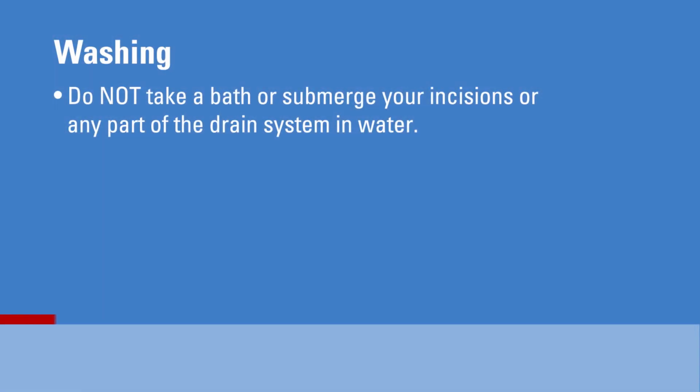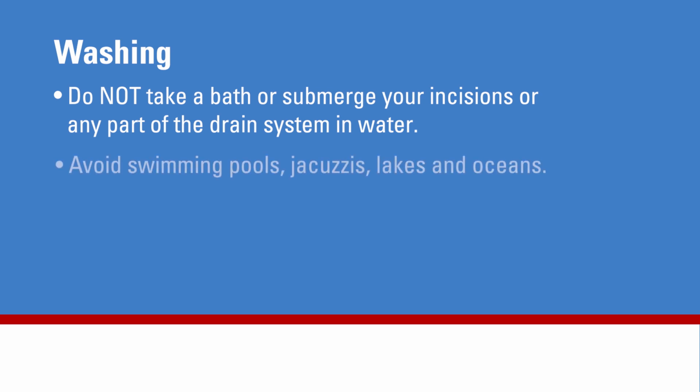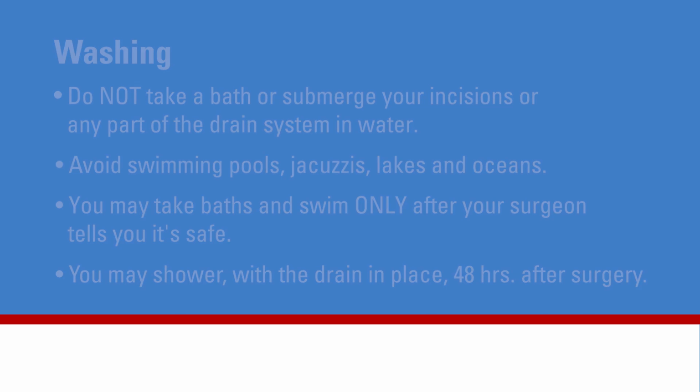Do not take a bath or submerge your incisions or any part of the drain system in water. Avoid swimming pools, jacuzzis, lakes, and oceans. You may take baths and swim only after your surgeon tells you it's safe to do so. You may shower with the drain in place 48 hours after surgery.